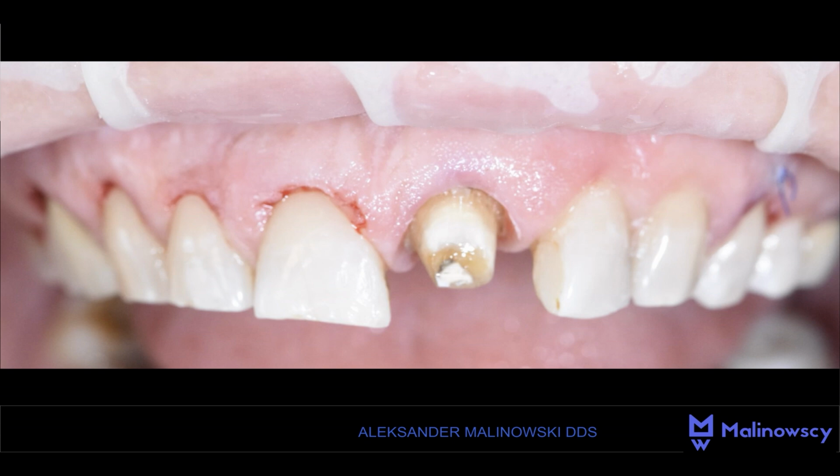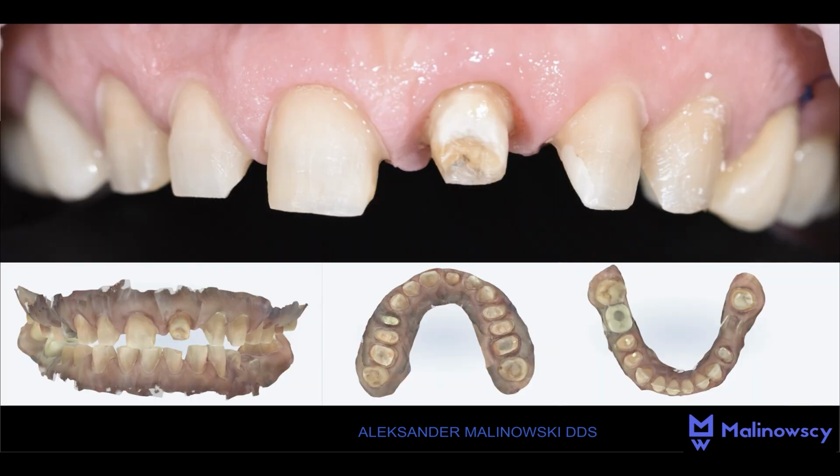Over the right incisor and the canine, I performed a correction of the gum level by simply detaching the flap and periosteum in the case of teeth 1-2 and 1-3, and detaching the flap and performing a gentle osteotomy through the pocket, obtaining respectively 0.5 mm in the case of teeth 1-2 and 1-3, and 1 mm in the case of tooth 1-1. Okay, and you can see the results.